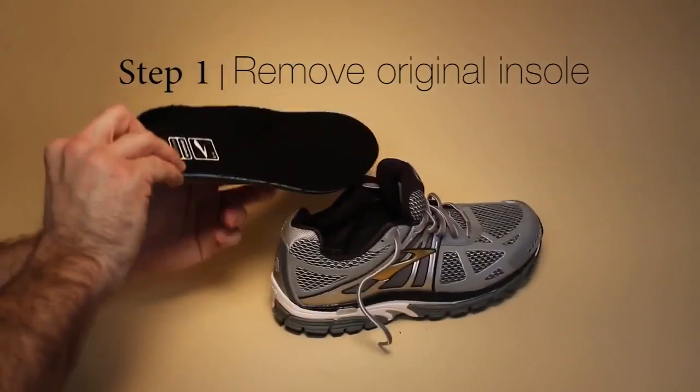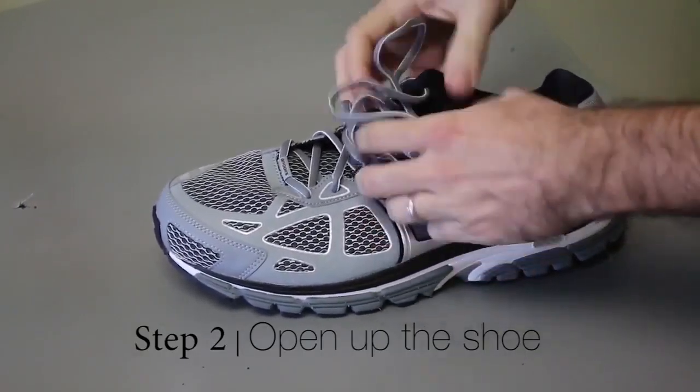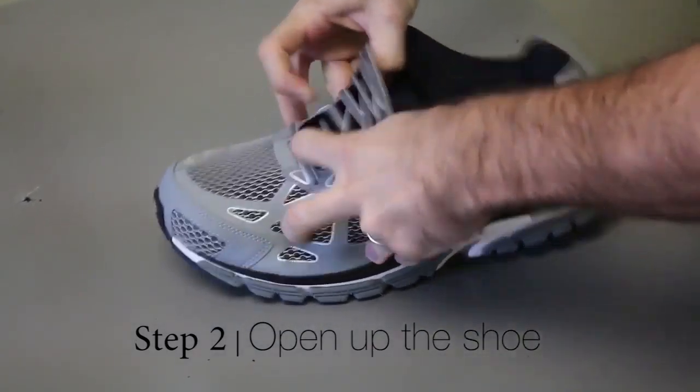Step 1. Remove any existing insoles in the target shoes. Step 2. Open up the shoe. Completely loosen the laces and pull up the tongue of the shoe as much as possible.